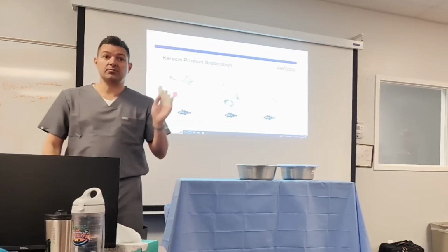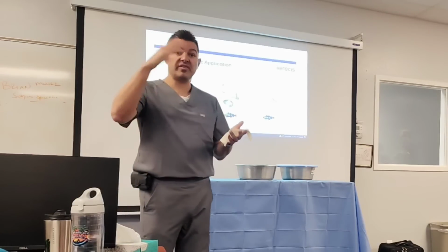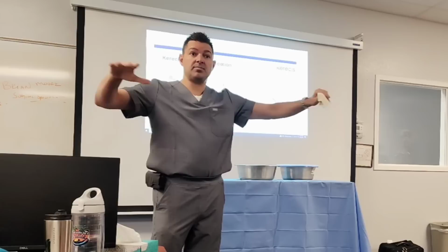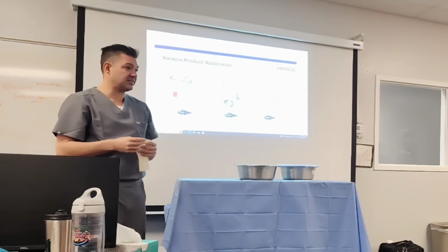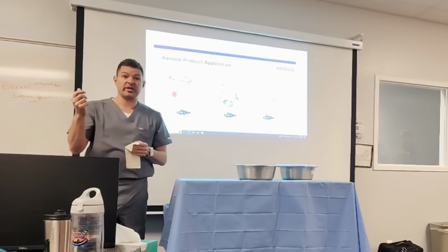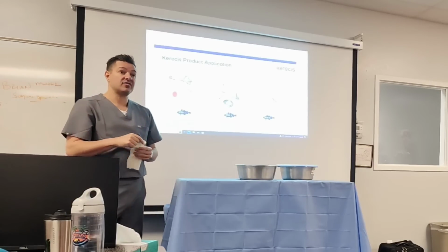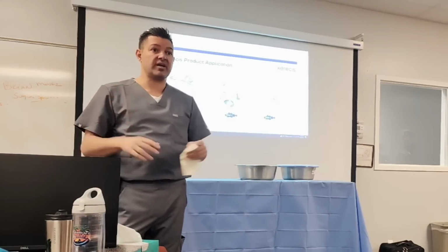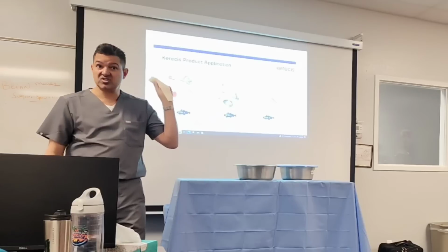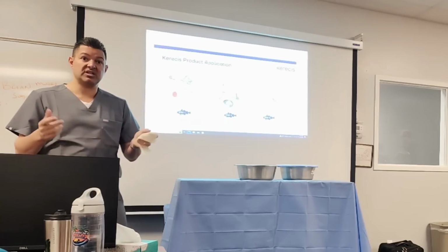So it's very, very important to apply some Vaseline or something on top of this with the veil, and that's what ends up keeping the fish skin sort of moist and active, so it doesn't dry up and turn more of a dark brown, blackish, okay? And then after that's done, we'll put, again, a gauze or something of that nature. And again, these are stapled, typically for burns, is what we'll see.